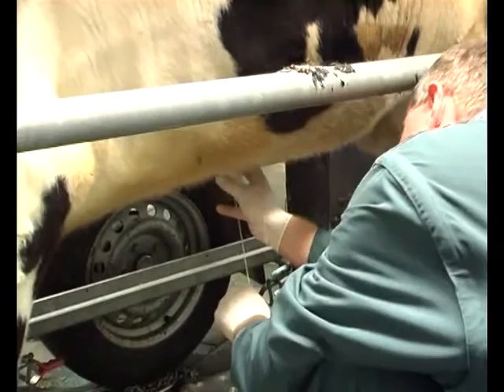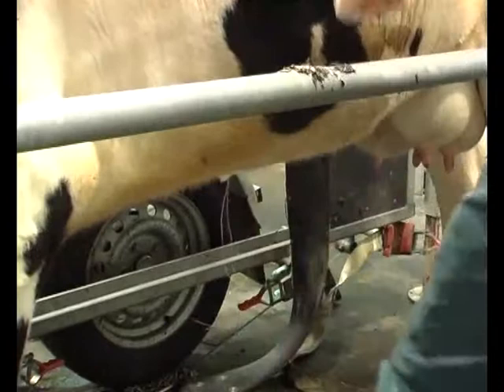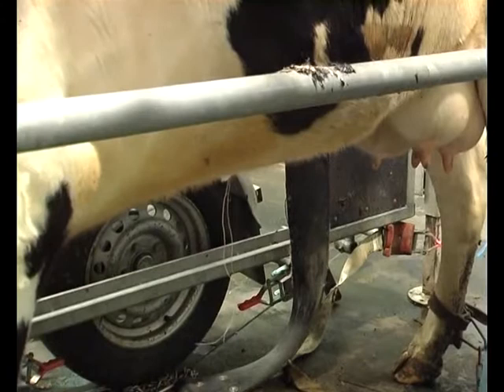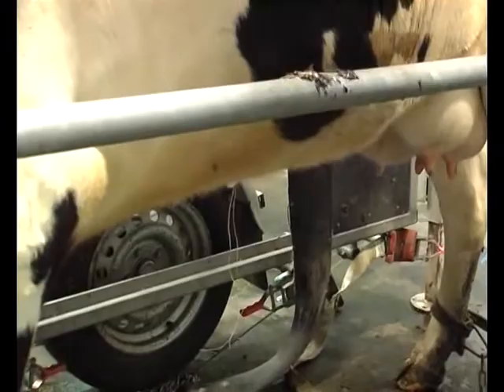Sometimes, last week I did an operation and there was too much tension. And I had a look at the displaced abomasum. I saw a bulb of air still on the left side. Then I took in the toggle placing trocar again, took away the bulb of air. And then the abomasum came like an optimal fish to the other side. But I've seen the black marks, so that's only five centimeters, I know I'm fine. So I can make a final fixation now.